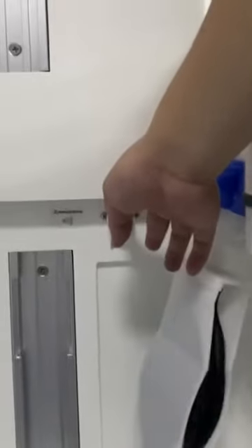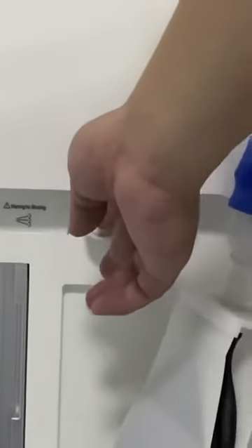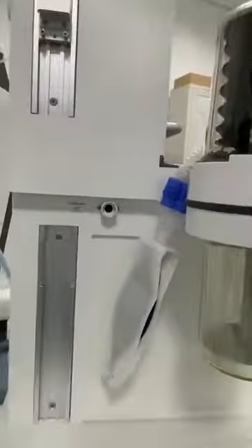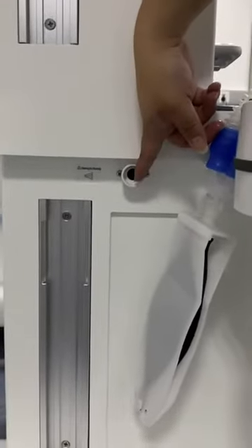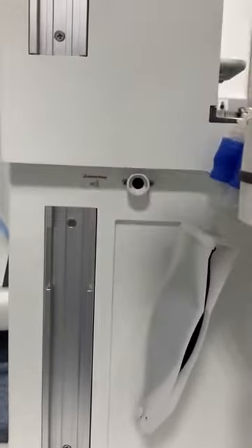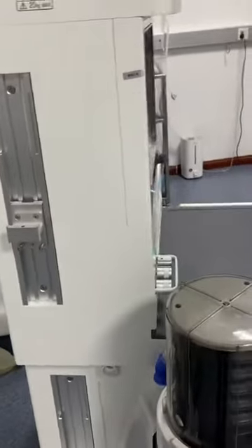And here we have a gas port. This one is for the AGSS. For example, the waste gas will come out from here. And usually we will connect it with a pipeline, and on the other side we give it out through the window. So the waste gas will come out and go out of the patient ward. But you can also equip it with the AGSS. Then we will give a big bottle here to connect with the waste gas port. So then the waste gas will be collected and cleaned, and then it will be without any pollution.